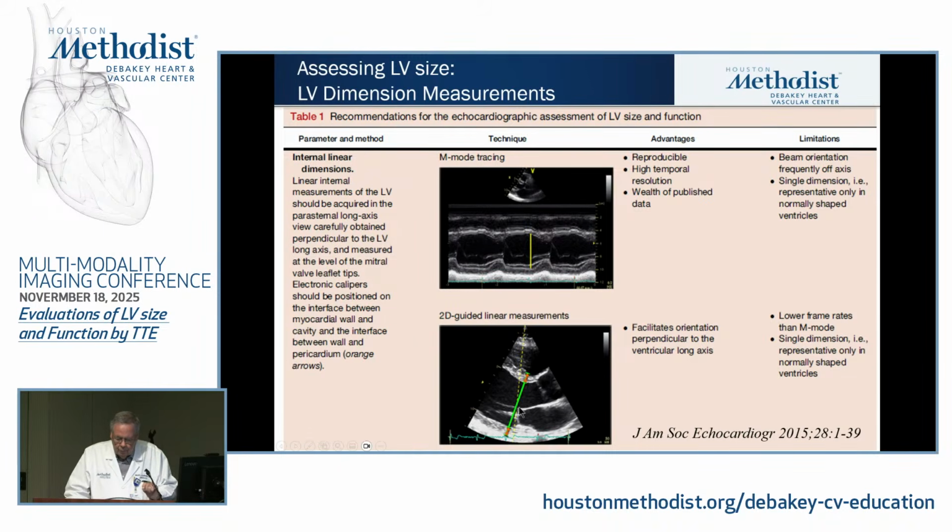The other thing that is very important is beware that for septal thickness, there is the moderator band here. And if you don't pay attention in real time before you pause the image, you may include that moderator band and end up with a septal thickness that is falsely increased, then providing a diagnosis of hypertrophy that doesn't exist. Likewise, there are papillary muscles and chordae down here that it is good to pay attention to in real time so that when you stop the image, you don't include them in the posterior wall thickness. So those are little tricks that are very helpful so that you have a more accurate measurement.